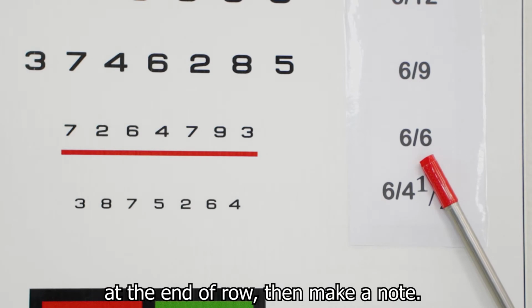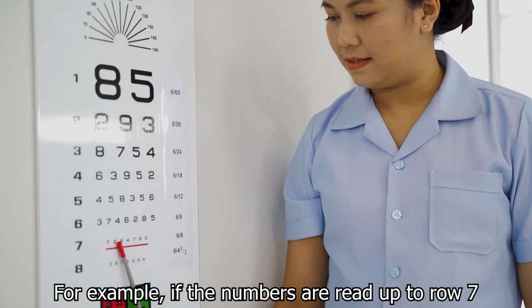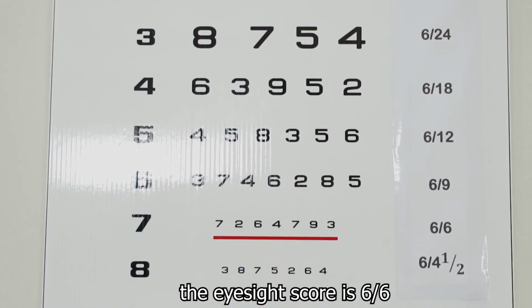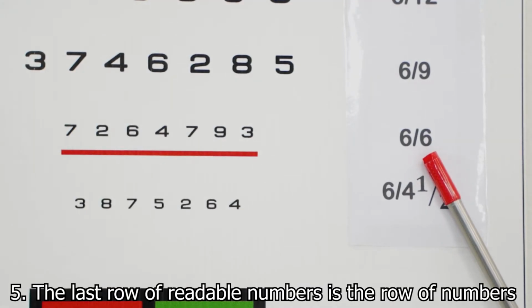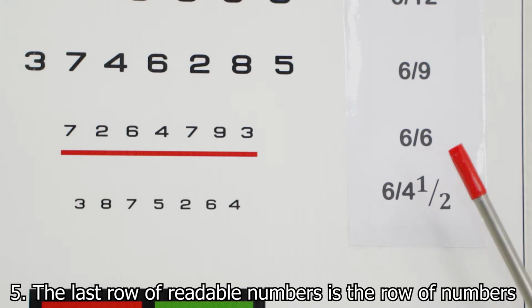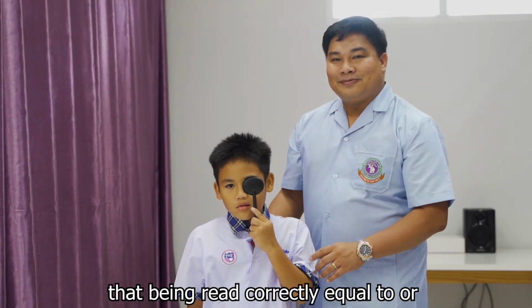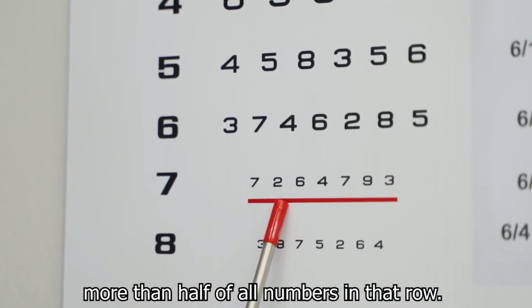Then make a note. For example, if the student can read up to row 7, the eyesight score is 6/6. 5. The last row of readable numbers is the row where the numbers are read correctly equal to or more than half of all numbers in that row.